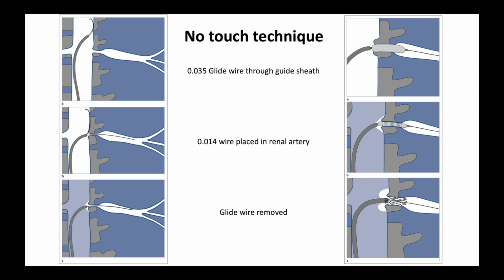Ostium must not be missed. So hang the stent slightly into the aorta, 1 or 2 millimeters, and then you inflate and deploy your stent. Be careful with your inflation. If the patient starts complaining of pain, you need to stop there. Usually that's a lot of stretch coming on, so we do not go much beyond the point of pain.